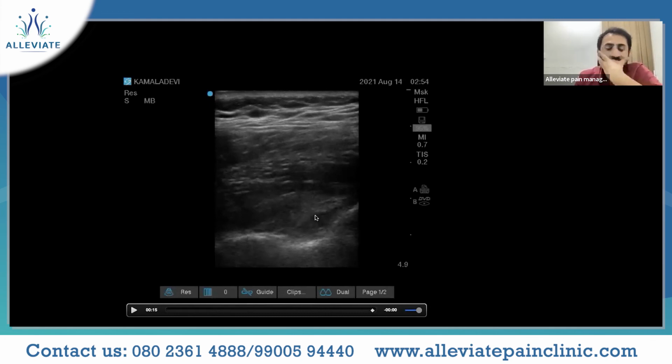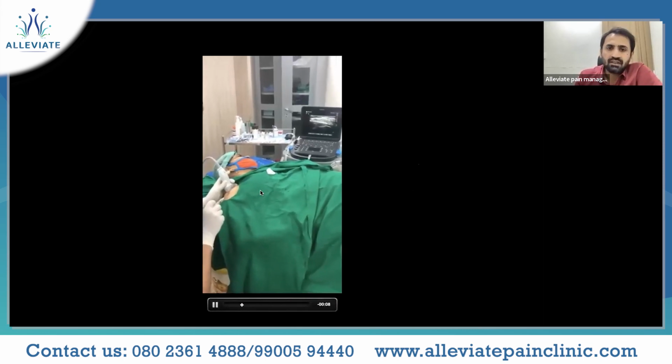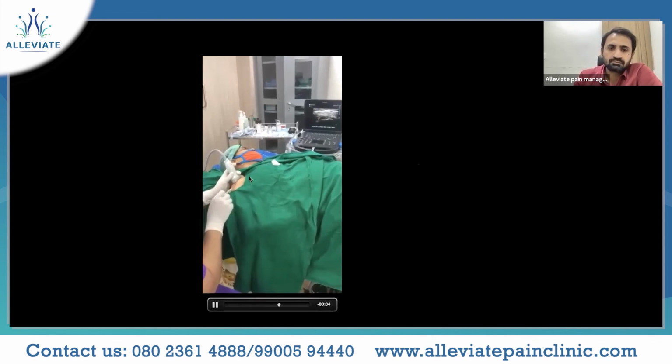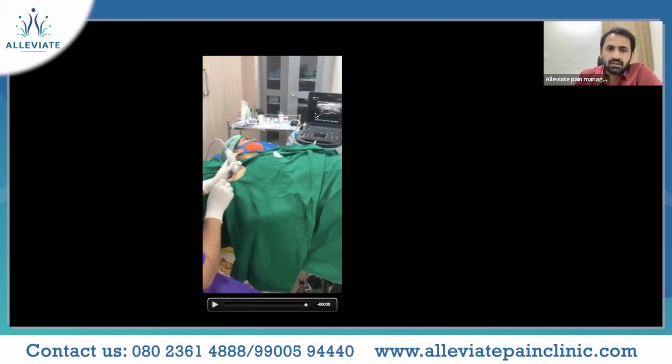supraspinatus or infraspinatus PRP. This is again an in-plane needling, wherein you can see the ergonomics. You can see the patient is also quite comfortable. We've given a block. You can see the needle there in plane. You can see the supraspinatus there.